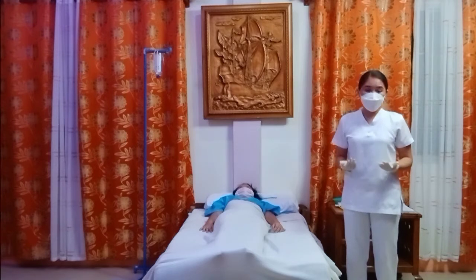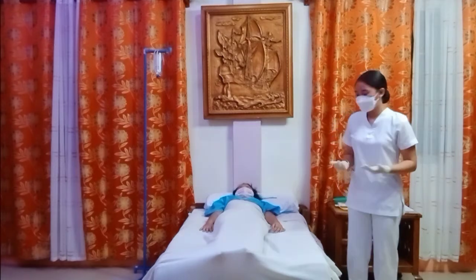Next is to place the client in an appropriate position.